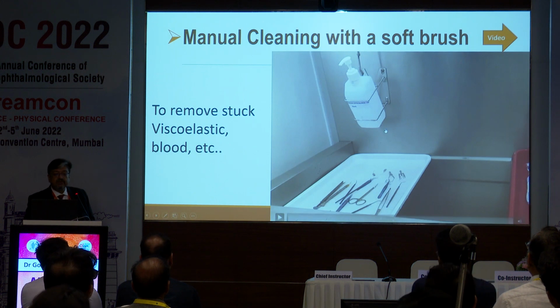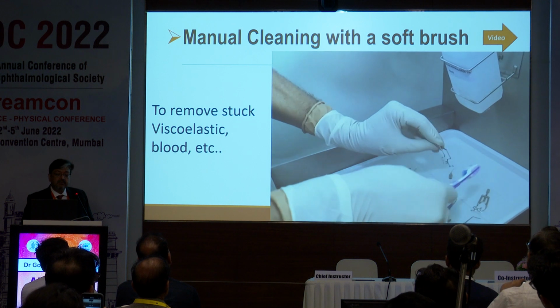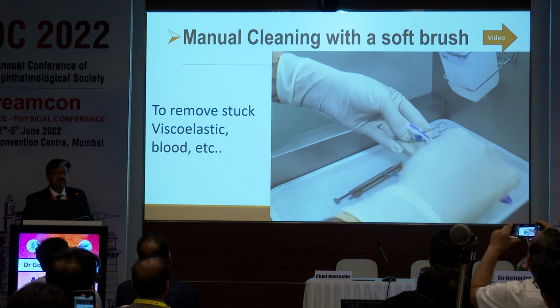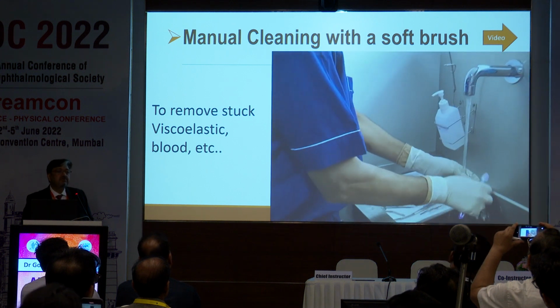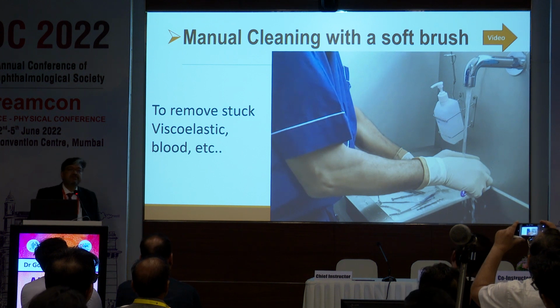Before we take the fine instruments into the other area, they can be cleaned with the help of non-ionic solution or even distilled water for a start, using a soft brush, which helps in not only cleaning the nooks and corners of the instrument, but also prevents the instruments from getting spoiled because of manhandling.